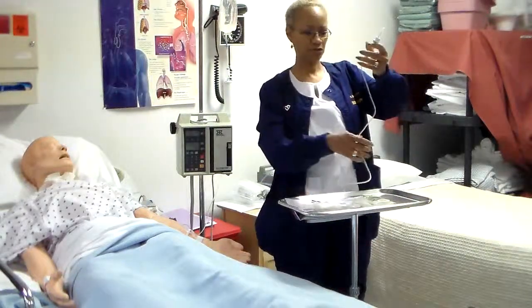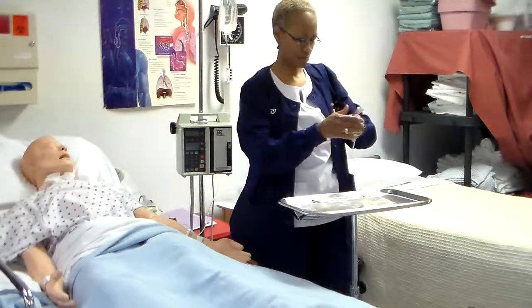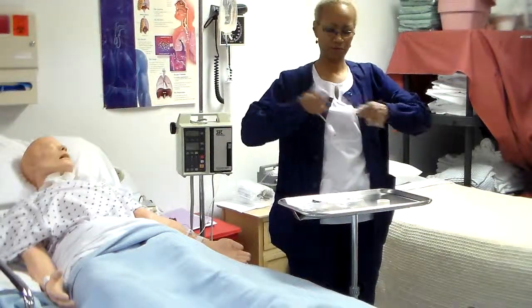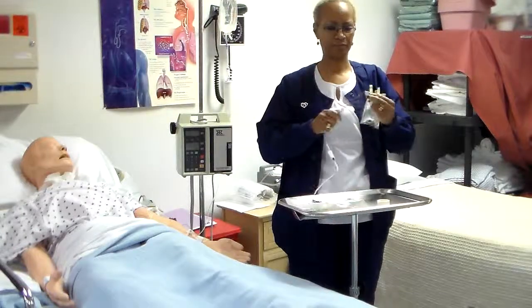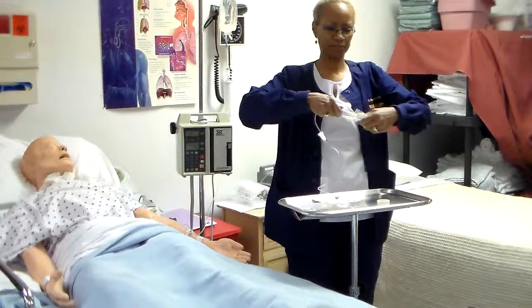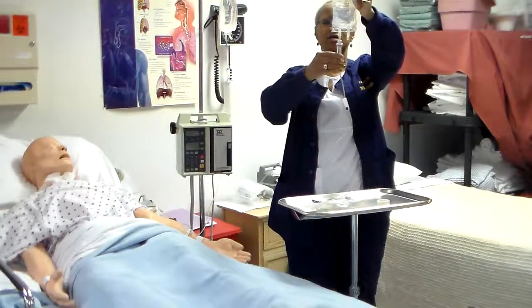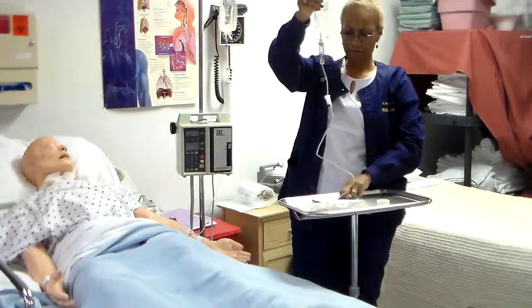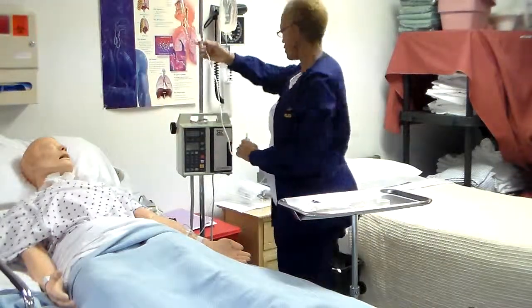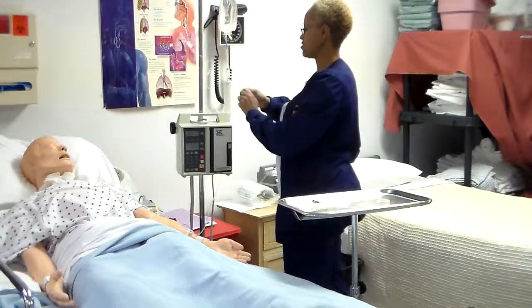So the first thing you're going to do is always close your clamp. And you're going to make sure that you keep your hands sterile. Use a twisting motion. Let a little bit of fluid, about a third of your drip chamber, in. And then you can hang your bag, take off your cap. Again, keep the ends sterile.